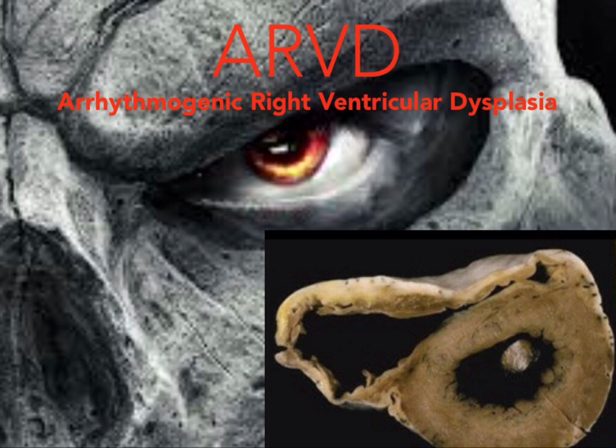The reason that we want to know about epsilon waves is because they can be a sign of ARVD, arrhythmogenic right ventricular dysplasia, which is bad. This is rare. It's inherited a lot of times, genetic transmission. I think it's a dominant type of passage through the family, but does not have complete penetrance, so it might have a family history, but not everyone necessarily will have it.